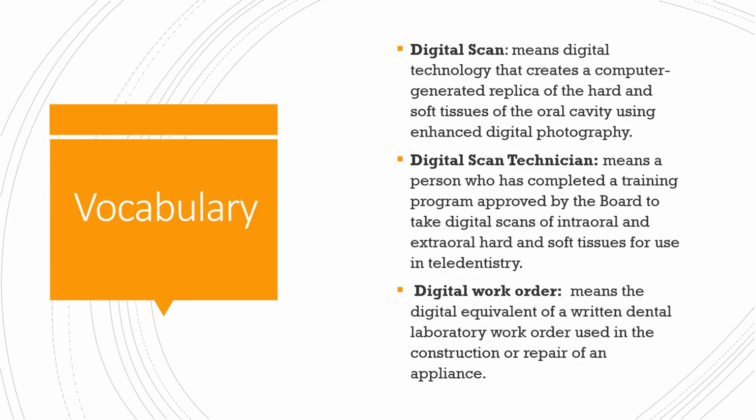A digital scan is digital technology that creates a computer-generated replica of the hard and soft tissues of the oral cavity. It uses enhanced digital photography. So depending on the machine itself, it's either going to take multiple still images or it's going to take a video of that intraoral cavity.